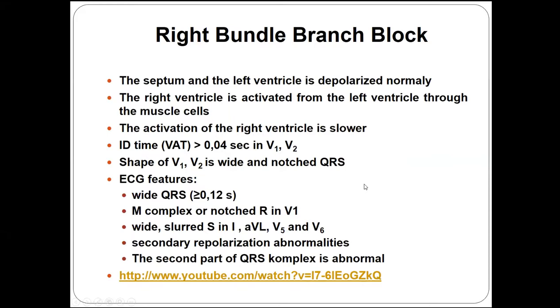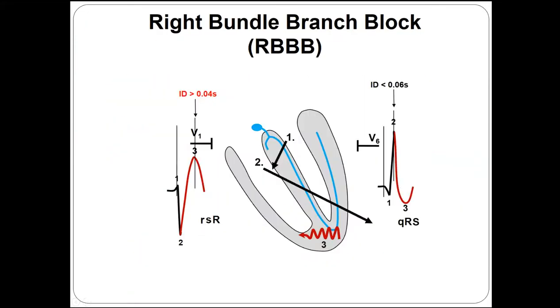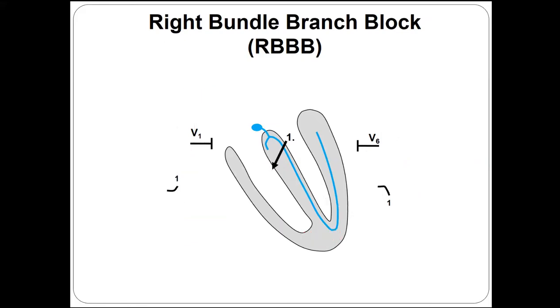Professor, can you explain why in V1 the R is first and in V6 the Q is first? Which one are you talking about? Here. Okay. In V1 the R is first.